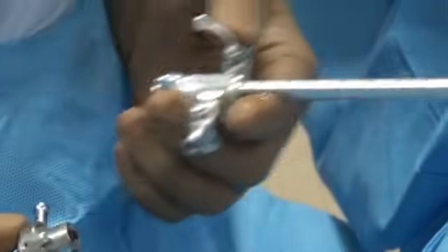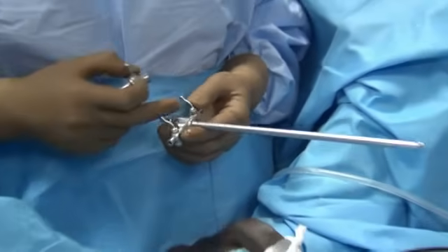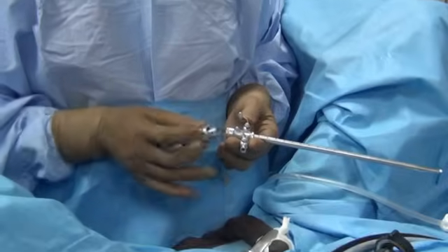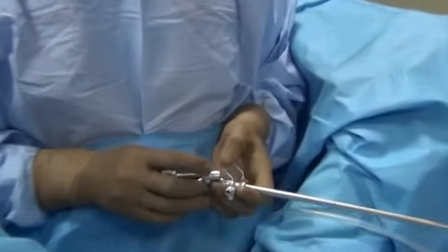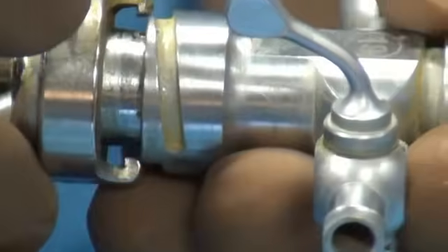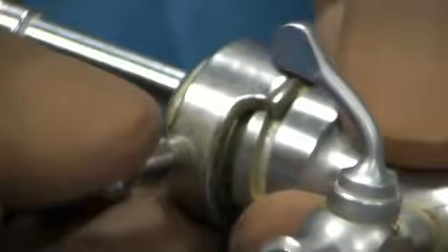Let's see how to assemble the cystoscope and the important points to note. This is the cystoscope sheath. First, take the bridge and apply it to the sheath. There is a zero marked on the bridge and a zero on the cystoscope sheath — you have to connect zero to zero and then rotate to lock. It is important that you lock it properly.